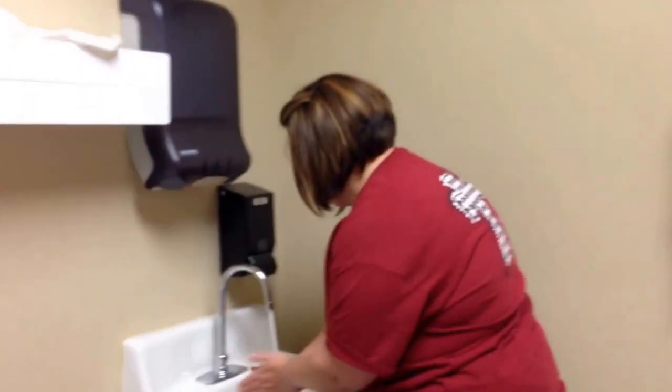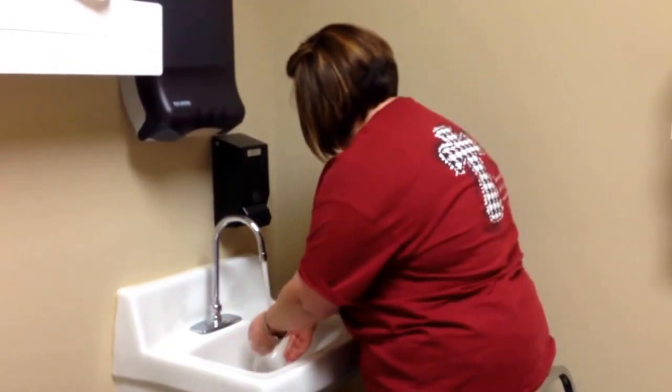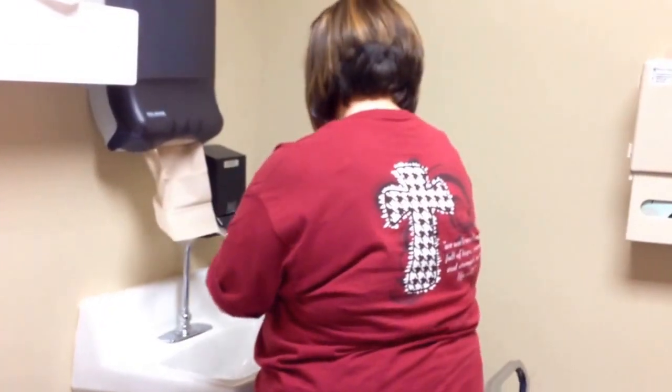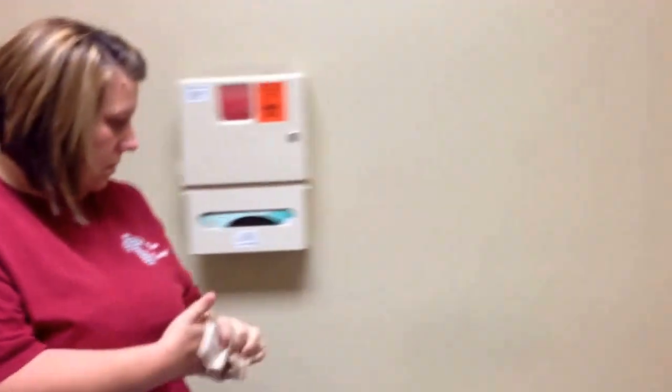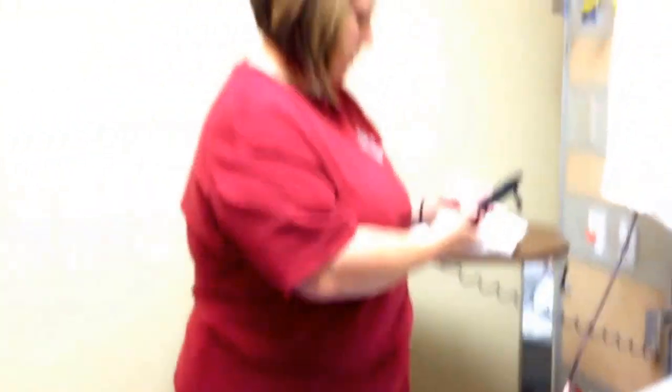I've verified his identity and asked the appropriate questions. Now I'm going to perform hand hygiene. All right, Mr. Dunn, I got my hands washed, we're going to get started. The first thing I'm going to do is raise your bed to a more comfortable height for me.